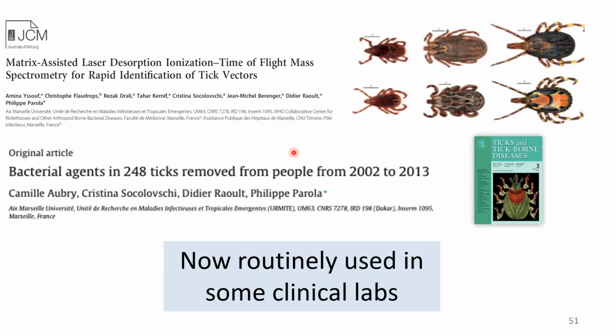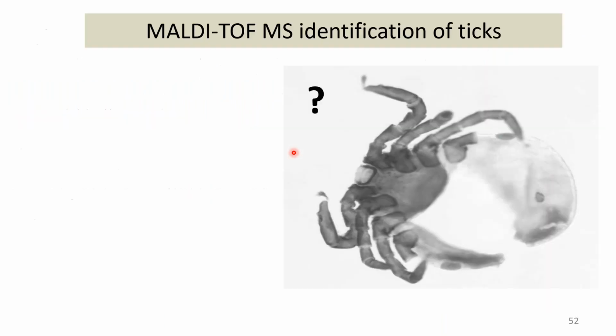And it worked so well for all those ticks that it's now routinely used in some clinical labs, especially the lab I was in a few years ago in Marseille. They published the results of the identification of ticks and also the pathogens they carry, ticks that were actually removed from patients, and it's actually the technicians that are identifying those ticks using MALDI-TOF.